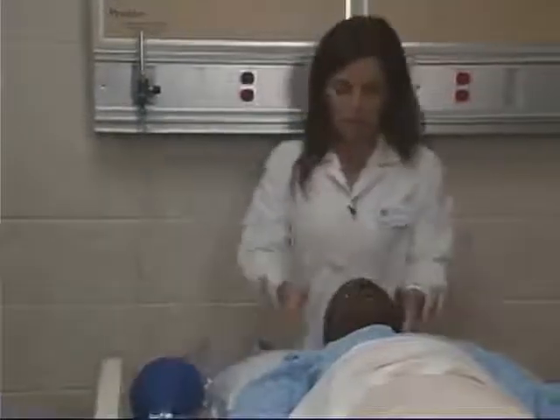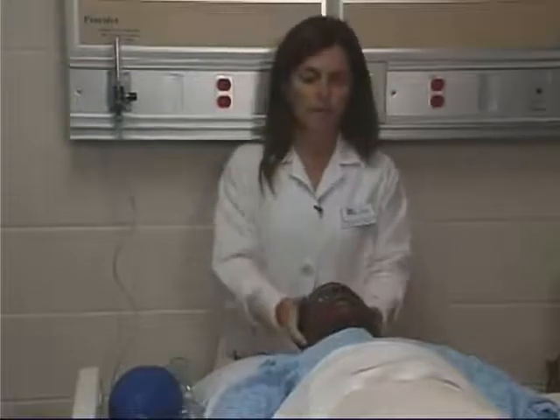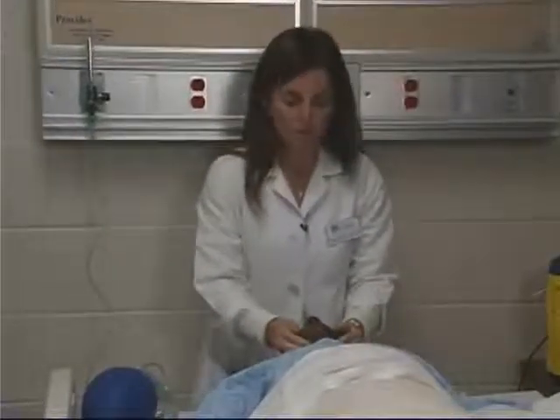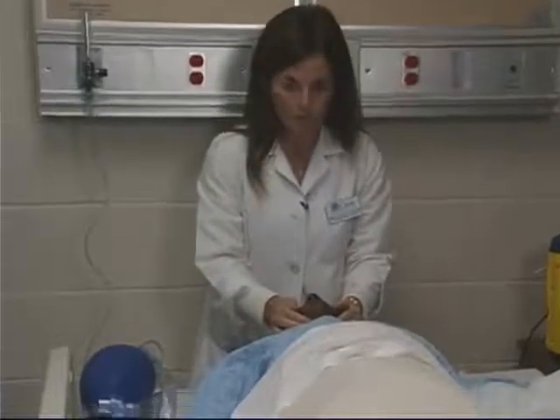Once you have oxygen flowing, you want to stand behind the patient at the head of the bed, have the bed at waist height. You want to have your patient's head tilted, remove the pillow, and you want to push their mandible forward to open their airway and move the tongue away from the airway.